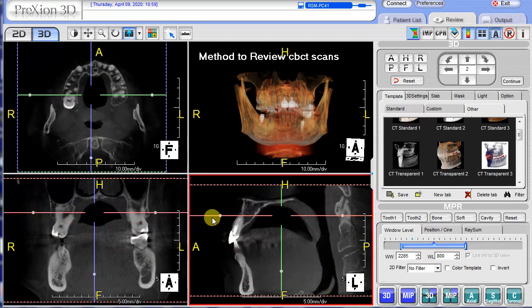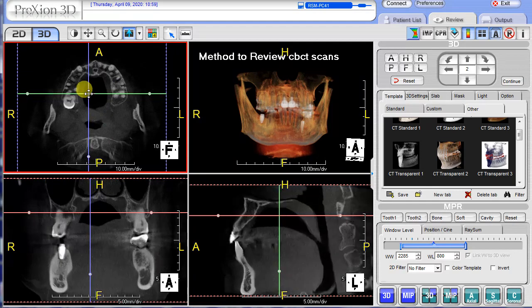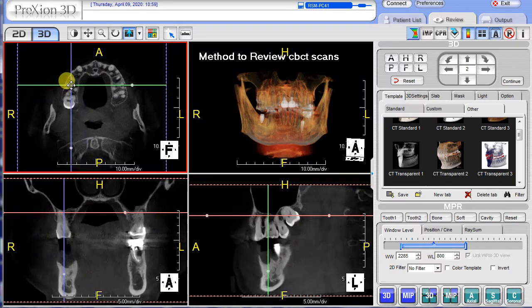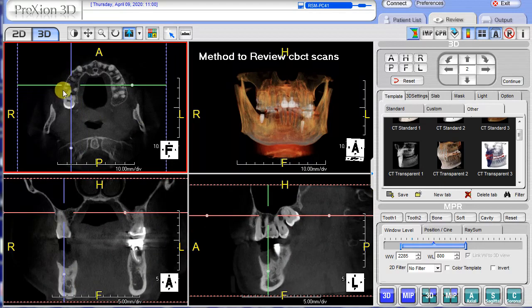Here in the maxilla, to evaluate the right side, put the arrow in between the crossbars or the target zone. Left click your mouse, drag over to the location and release. You will note the same location from the different planes: axial, coronal, and sagittal.